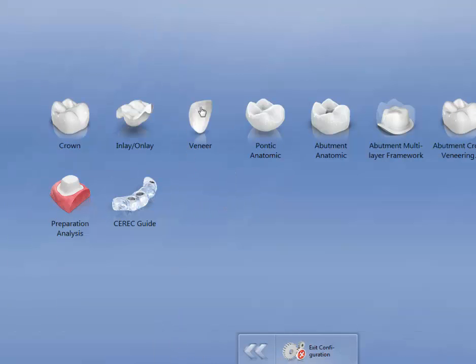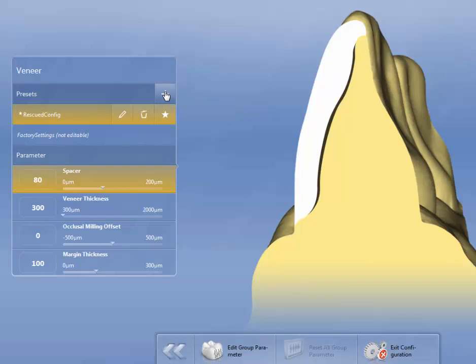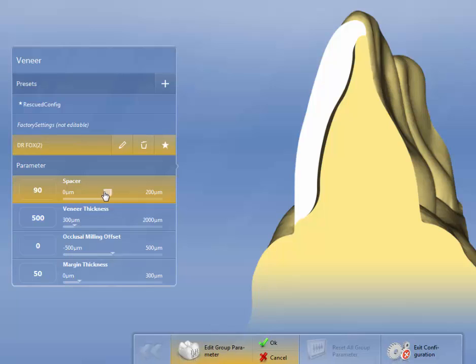Now we're going to do a veneer. And veneer, I'm going to again go to, instead of doing a factory setting, I'm going to do Dr. Fox. And spacer, because we're using a veneer, I turn this down to about 60 to 70 microns. I'm going to go down to 70. Veneer thickness, I like to make it as thin as I can.